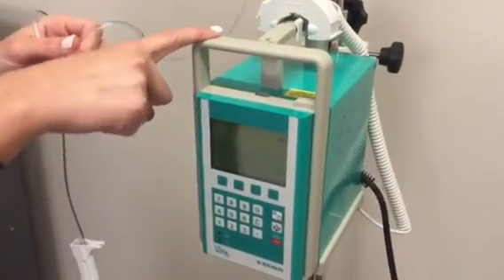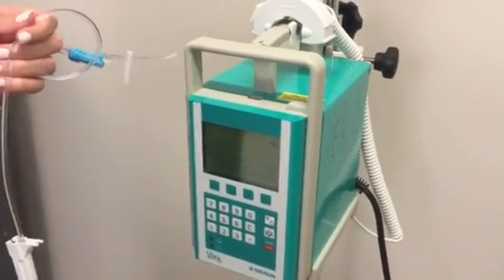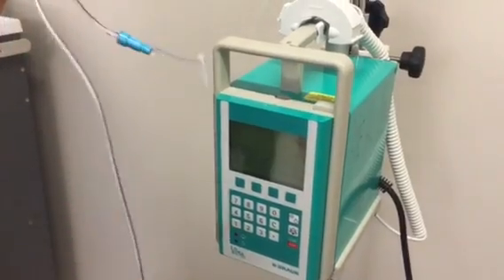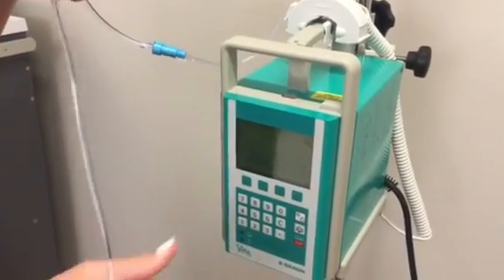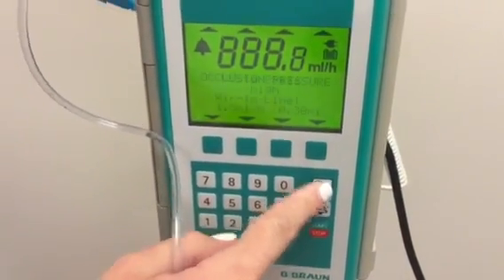This is our IV pump. First, really important to keep it plugged in — you don't want the battery to die when you're trying to run a medication through it. So we're gonna pretend like we're just gonna hang a bag of saline and run that at a certain rate. You're gonna hold this power button to turn it on, and you'll see the screen light up.